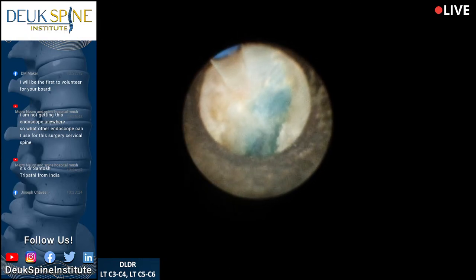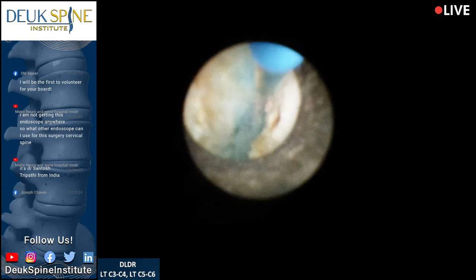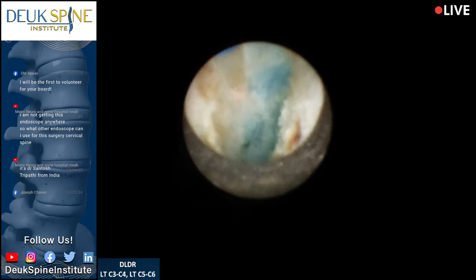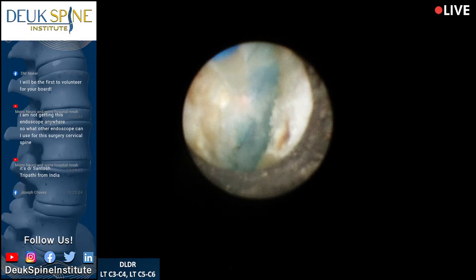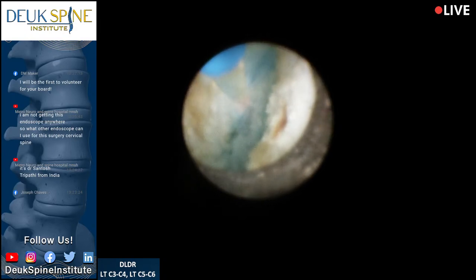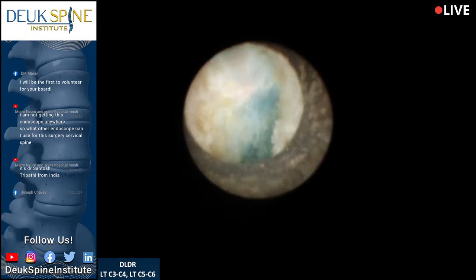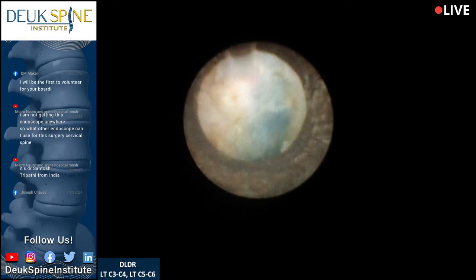Interestingly, you can see the tear is mostly on one side right there — it just goes to show that annular tears are not always in the center of the annulus; sometimes they're closer to the end plate.